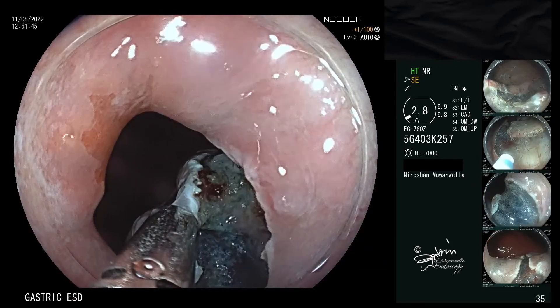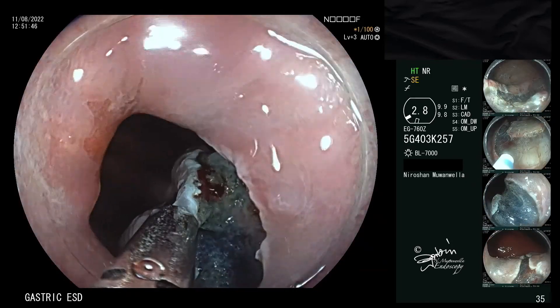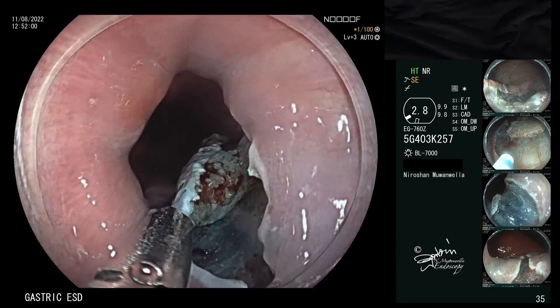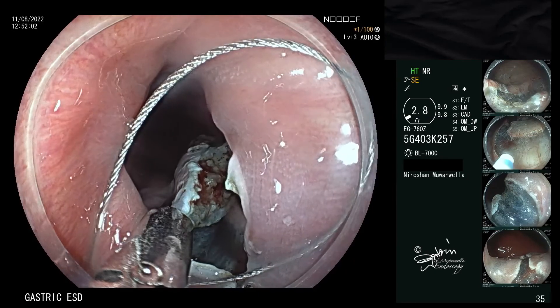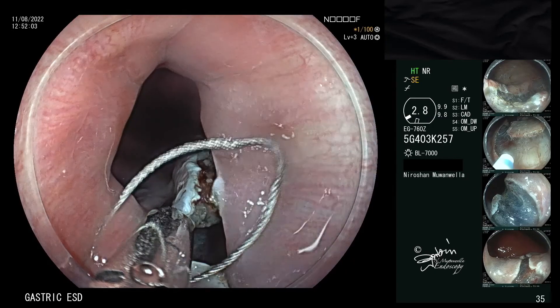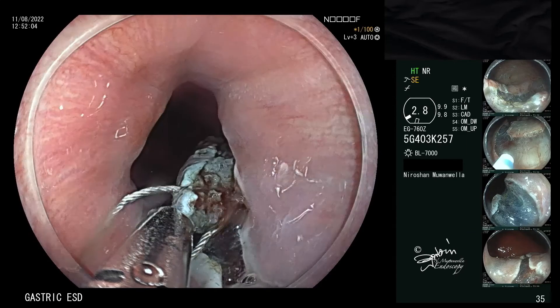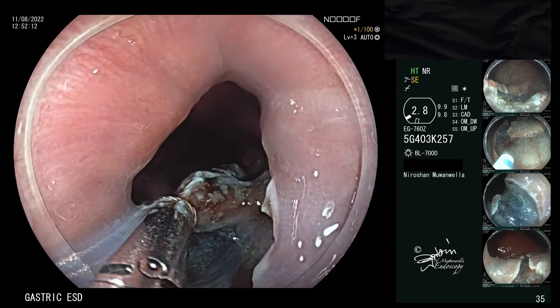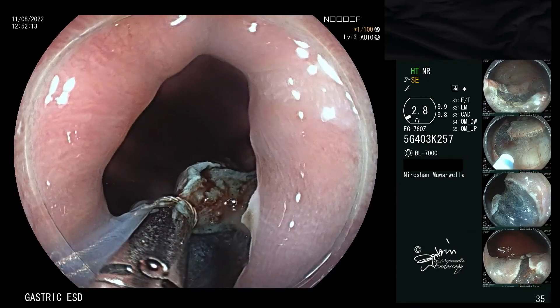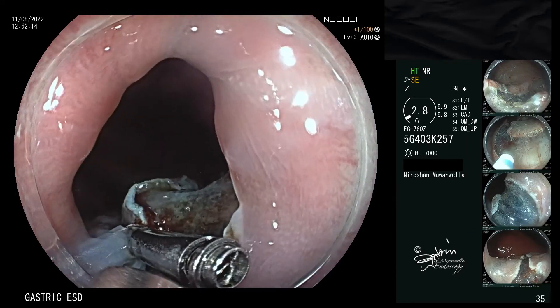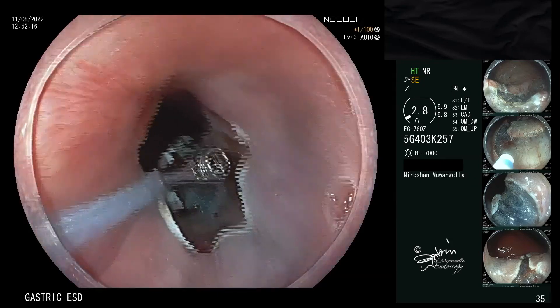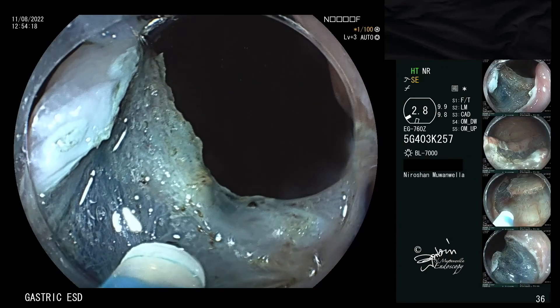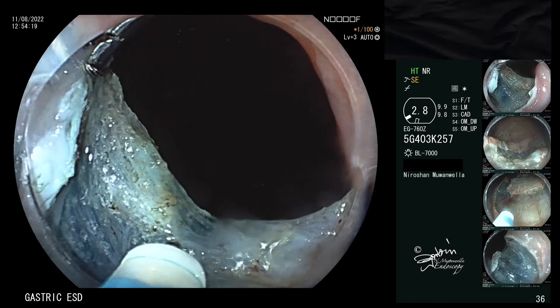Here you can see a clip and snare traction method being employed. This elevates the submucosa, making the submucosal dissection easier to carry out.